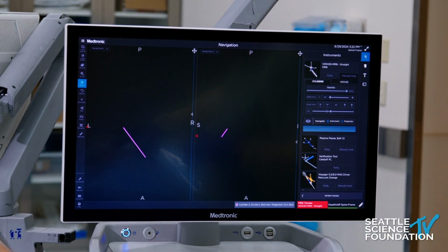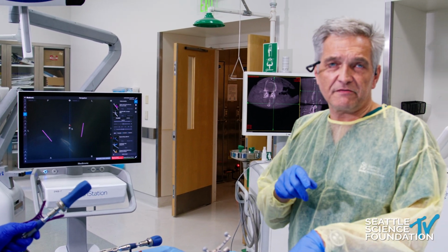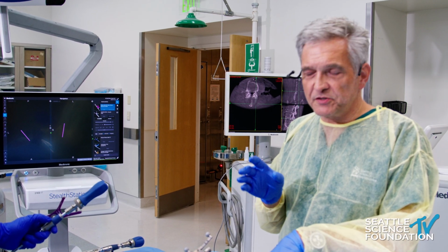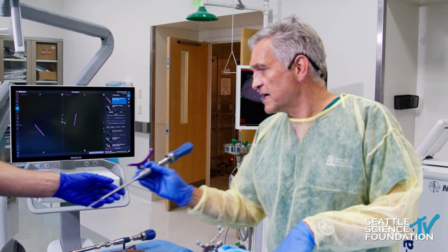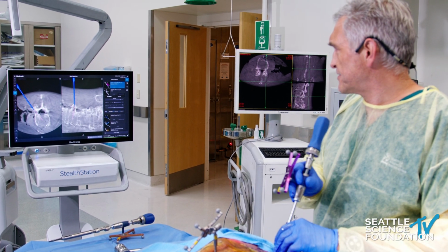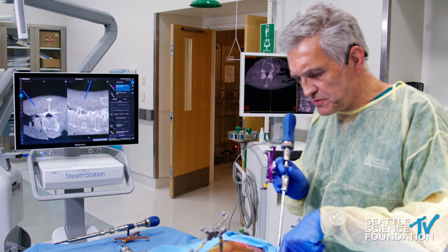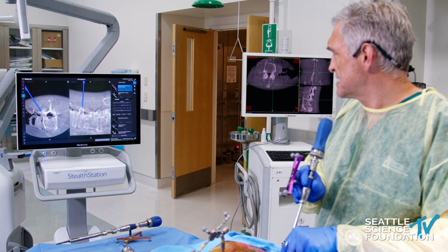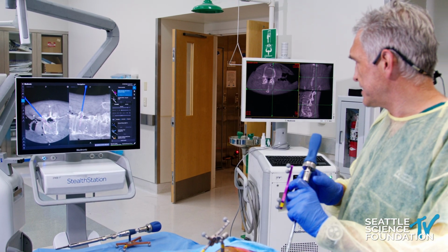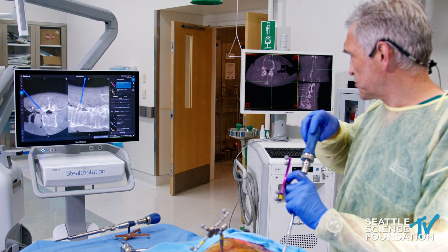So now we have, see, and that's the thing with freehand navigation. That's something with a robot you can't really do. Namely, that tactile feedback that makes you 150% sure, makes you feel safe and sure that the anatomy is right, you're in the right spot. And that's what I like about freehand navigation versus the robotic navigation. So now I have the awl here, the tap. And I'll go back into the anatomy, and I'll find that hole that I prepared with the burr. And now you can see I'm dropping into that hole already.